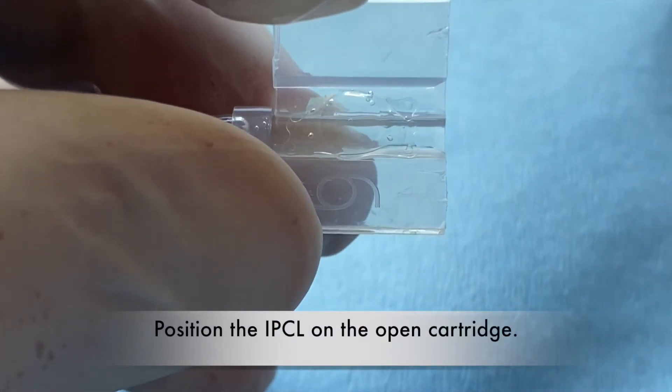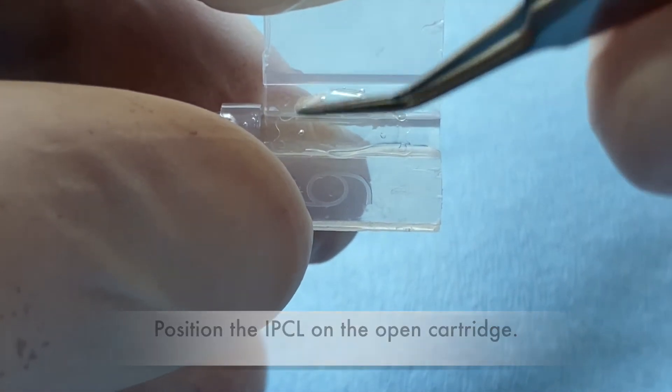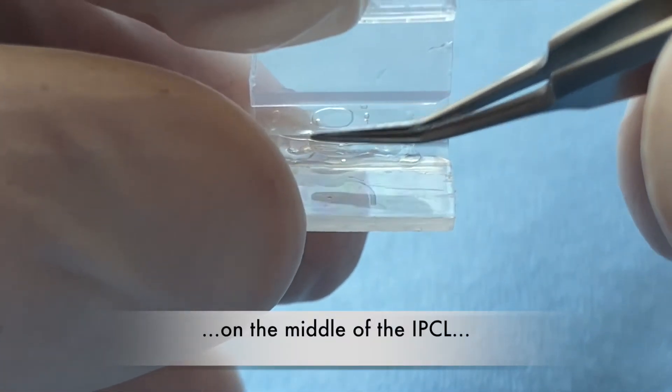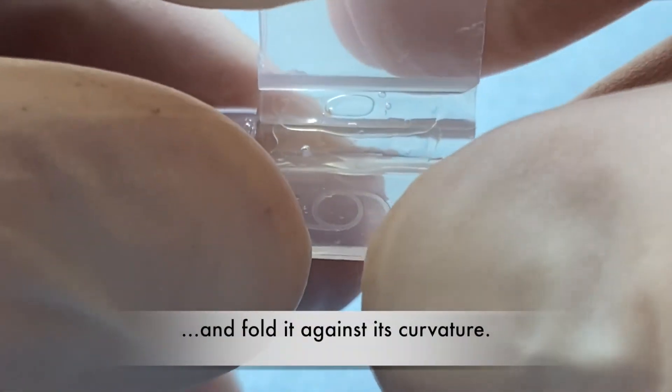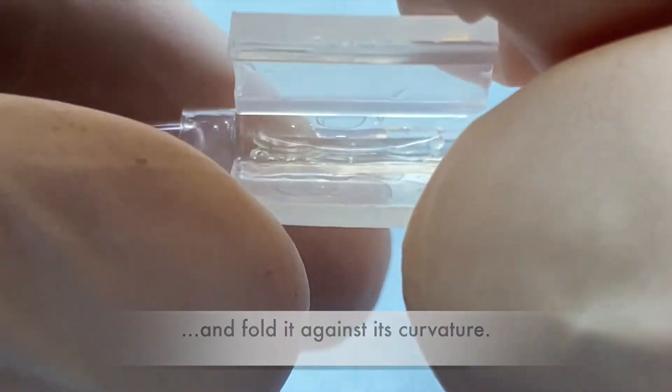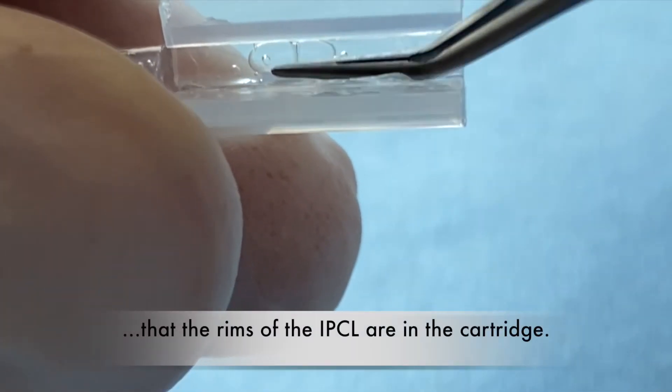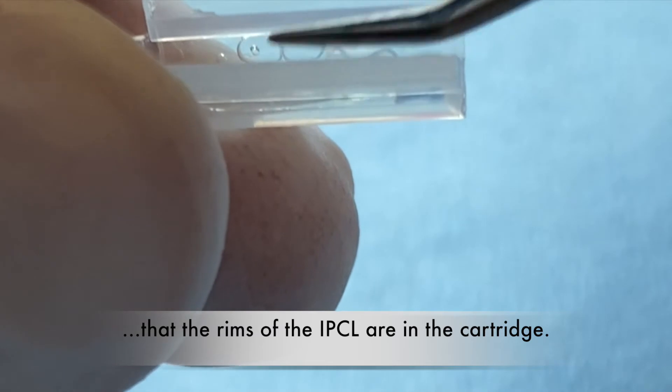Position the IPCL on the open cartridge. Press carefully with the closed forceps on the middle of the IPCL and fold it against its curvature. Close the cartridge by half and ensure that the rims of the IPCL are in the cartridge.